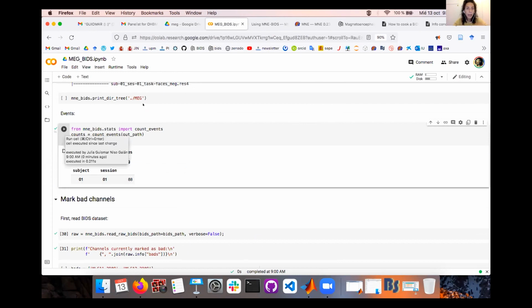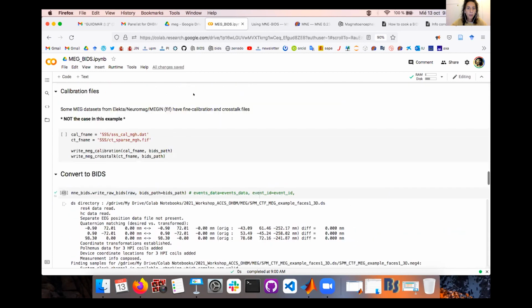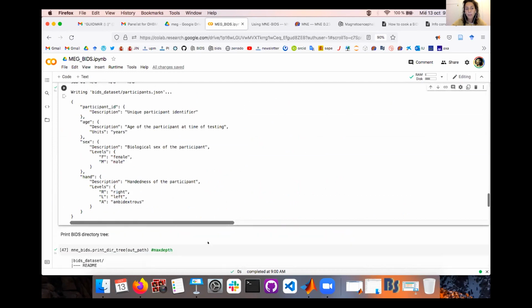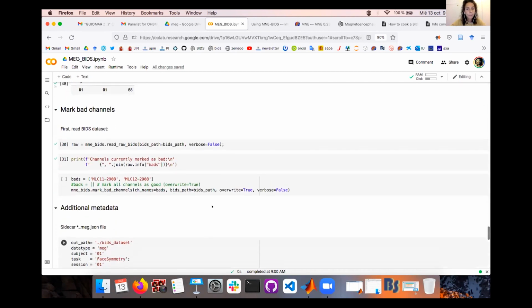But you can also add, as Remy was showing, a TSV file with the events, and pass it as an input to MNE-BIDS, and it will mark everything and synchronize everything accordingly. Let me show you. Here you just say events data and event ID, and this event ID is just a dictionary with the events. For example, trigger 1 is faces, trigger 2 is scrambled faces, and all this. So it organizes it there.